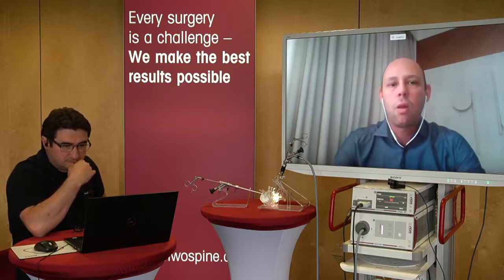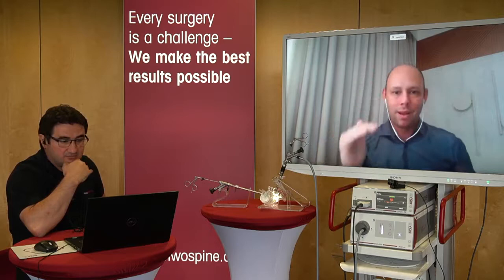But I had one case where the patient developed an epidural compression after a dural tear. But we don't need to suture the dural tears. Maybe I can put a cotton, no, I don't know the name, Gelfoam, or something like that, to stop the hole. But it's not a problem. You can go on with your surgery and finish it. I put the fluid a little bit lower. I decrease my fluid and continue my surgery.